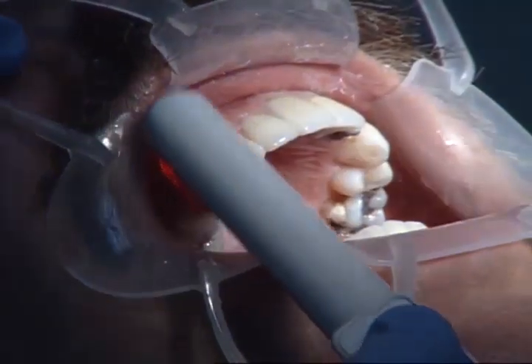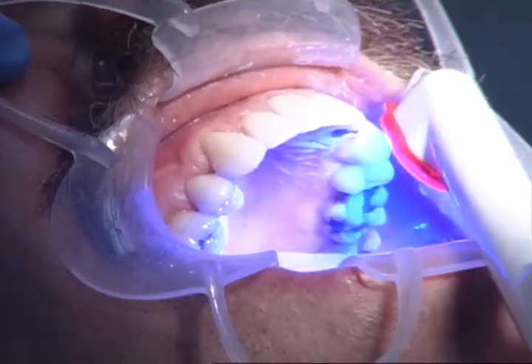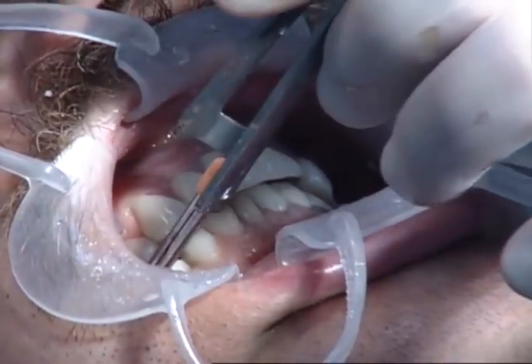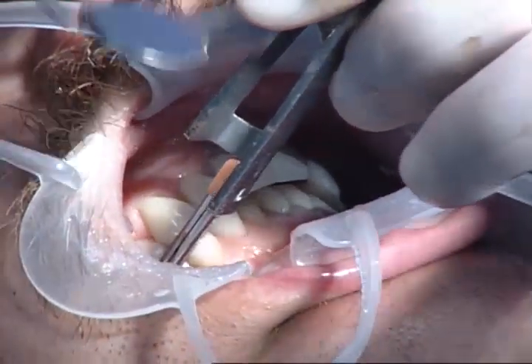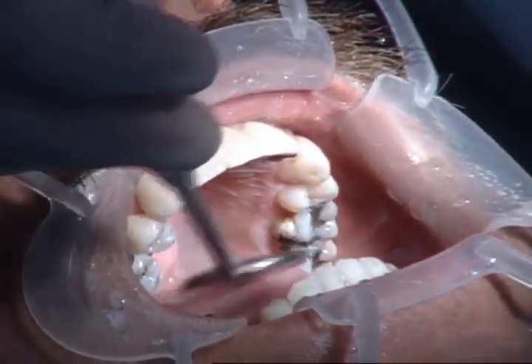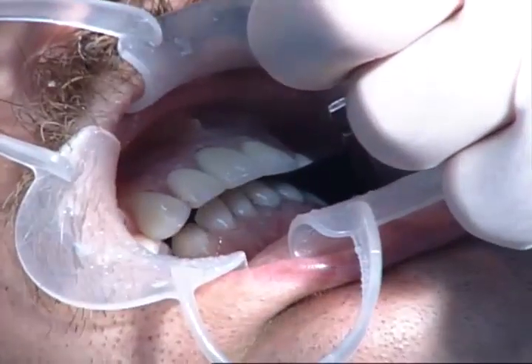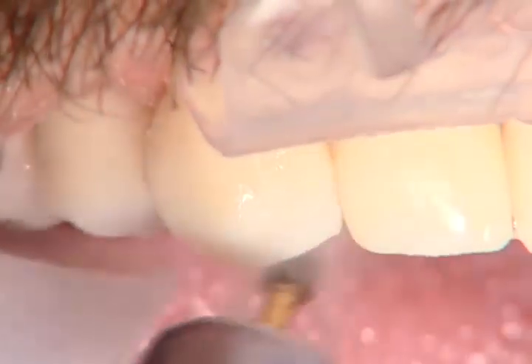These pressed, thin press ceramic veneers at 0.3 millimeters, I just don't see any breakage when I'm trying them in. I'm not hammering them in. You can see we're not checking occlusion here until they're bonded into place. It's not like you need to treat them as though they were tiny little pieces of styrofoam. It's not going to hurt you to treat them that way, but certainly, make sure that you've got a little pressure on them so that they're seated completely when you do go to cure them.